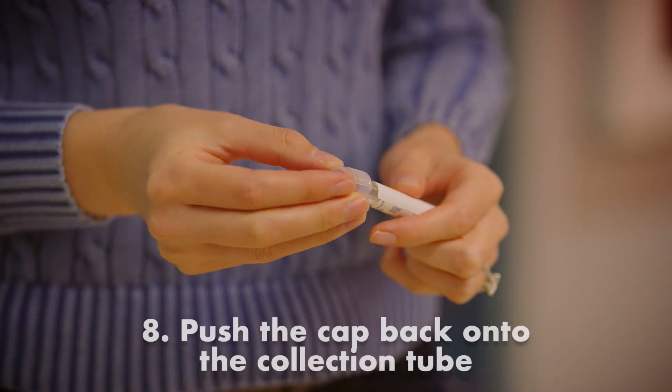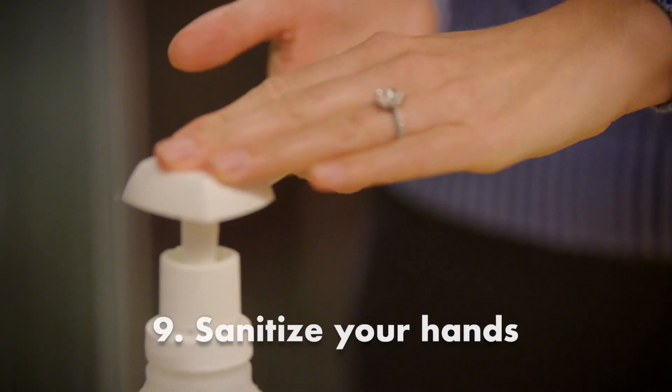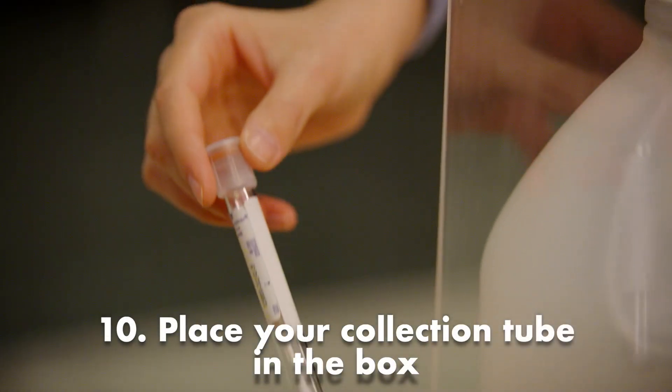Push the cap back onto the collection tube, sanitize your hands, and place your collection tube in the box.